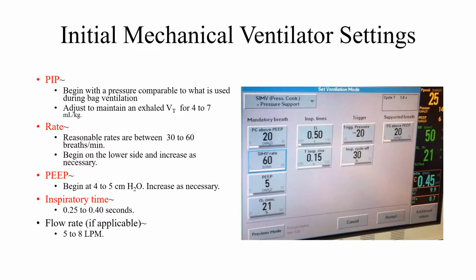Now, depending on which reference you use, you notice on the previous slide I said 3 to 8. It depends on which reference you're using, and it depends on if you're using a lung protective strategy as to which set you're going to use. Keep in mind, if you deliver surfactant therapy, your tidal volume can change very, very quickly with the same PIP, so you're going to want to be adjusting those appropriately and as quickly as possible when you notice the tidal volume is getting larger.